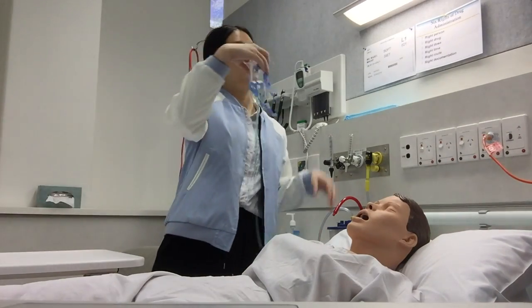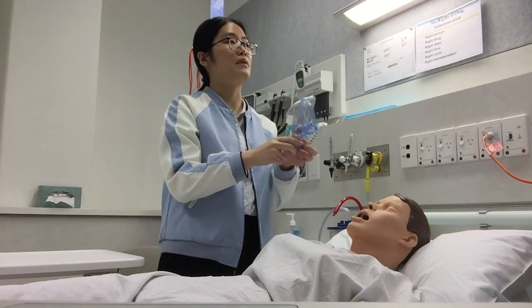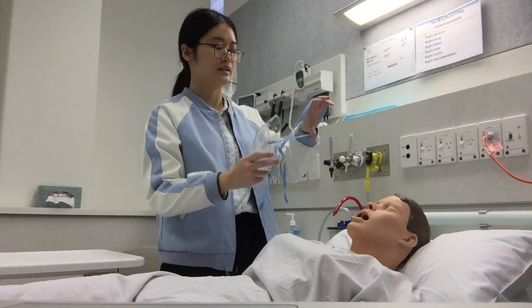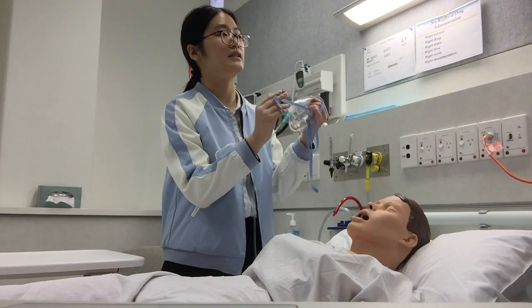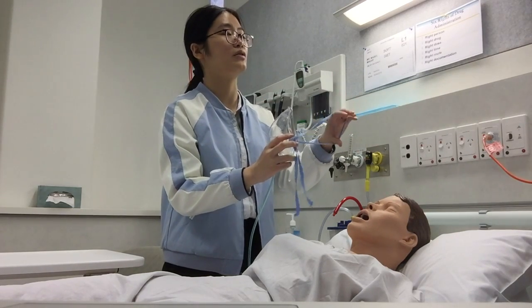So this one is a simple mask. It is also called Hudson mask. When you connect this one with the patient, you need to make sure that the elastic strap is suitable for the patient. It's not too tight or too loose.